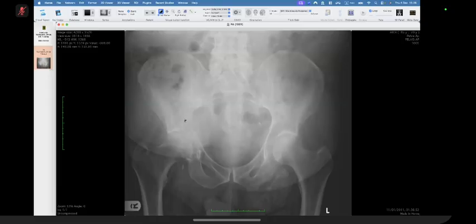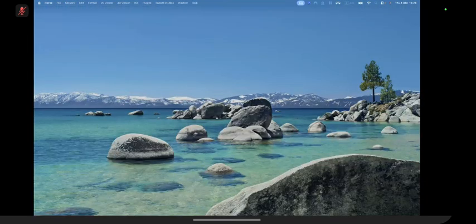This is the most important finding here. Everybody looks at that, and people then forget to look at the whole pelvis. So unfortunately, this is a fail. Sorry, there's no other way I can grade it. And this is a significant fail as well, because obviously it's a malignancy. So it's something that the examiners are not really going to be looking at favorably.